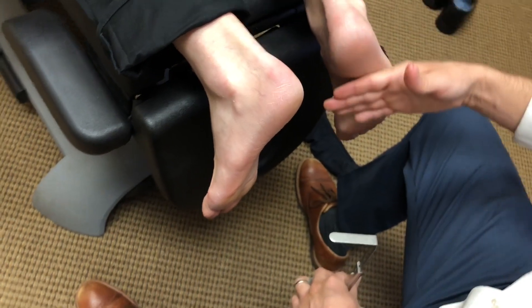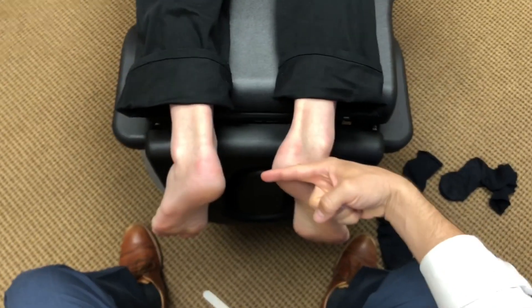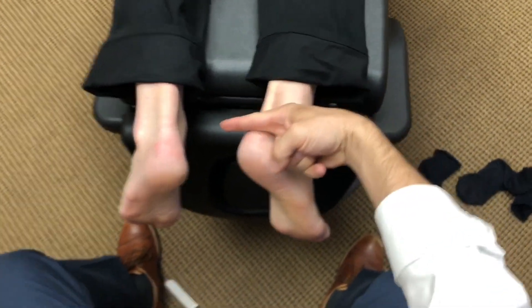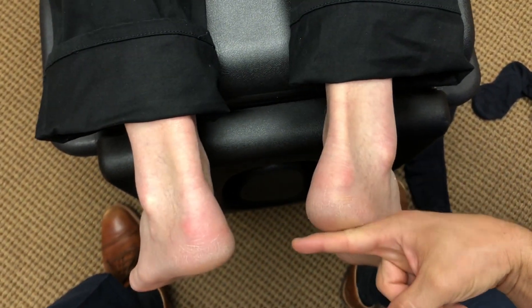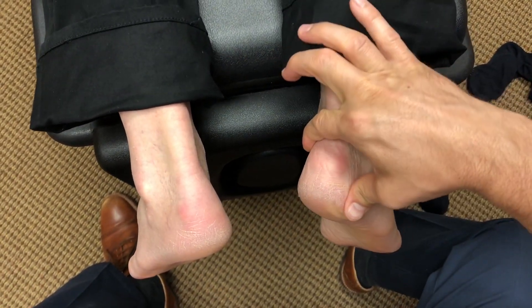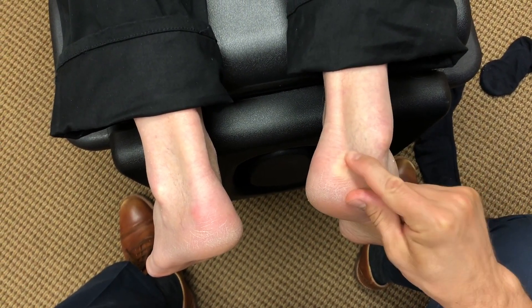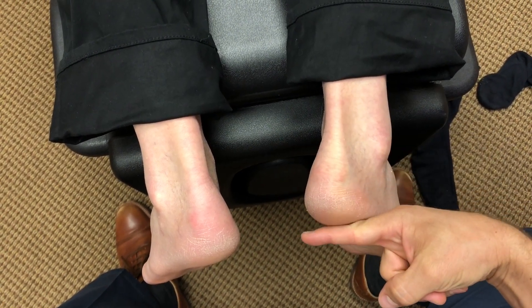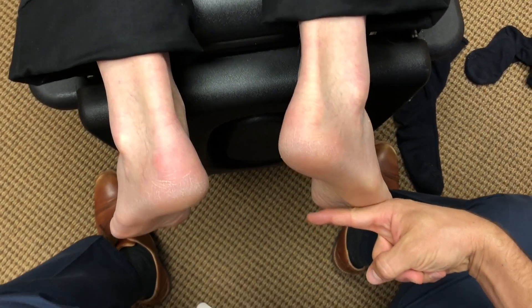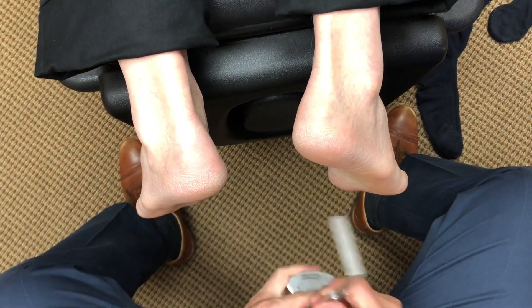On this side, you can see there's a little bit more of a pitch angle. My finger is representative of the ground. You can see there's a little bit of a rear foot varus angulation — slight. You can see a little tubercle in that calcaneus. The angle of the forefoot on the right is a little steeper than the angle of that forefoot on the left, so we're going to measure this one.